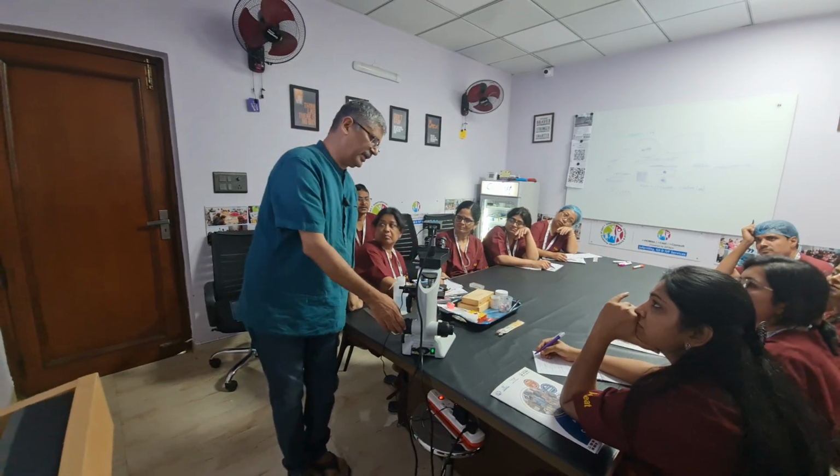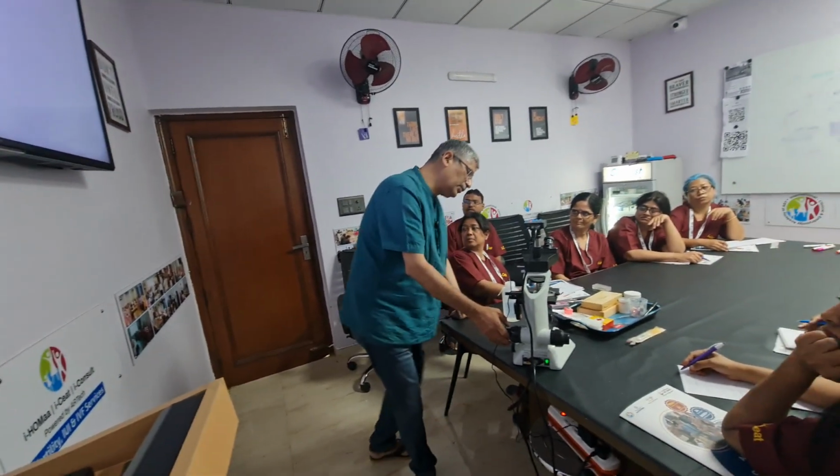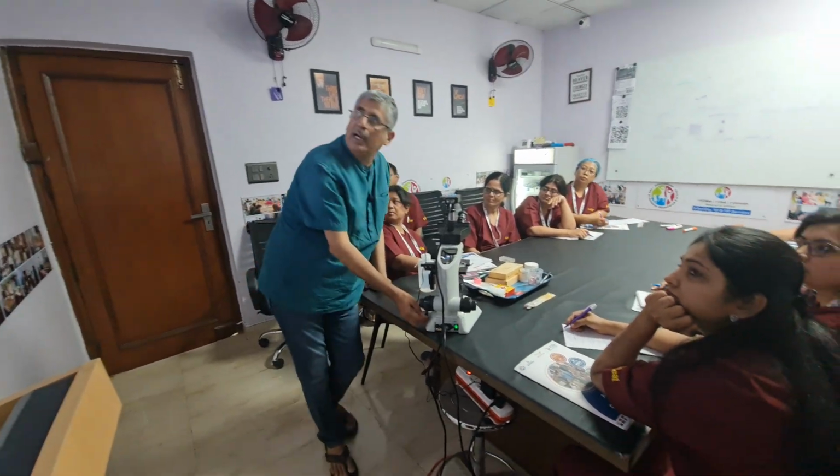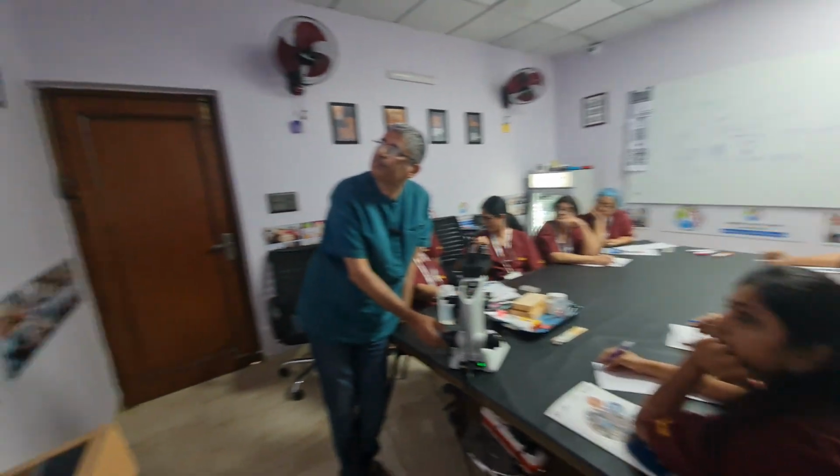I was on 40. From 40 I have come to 20, and this is what we are seeing on the screen. Can you see this? Yes, sir. This is what we are getting here. Some of these sperms are moving fast. This is the image we are getting, and we are very happy with this image. So I am at 20x now.